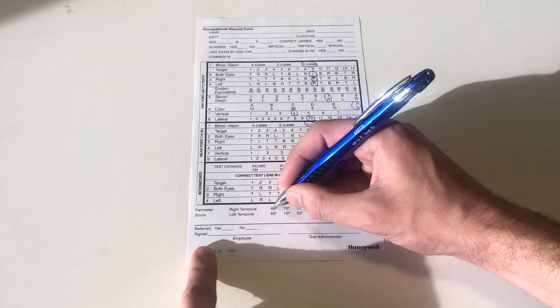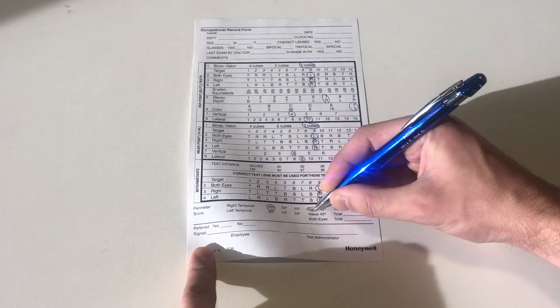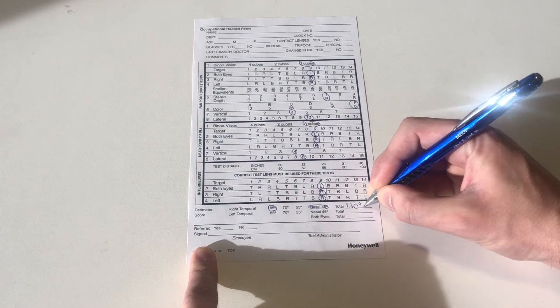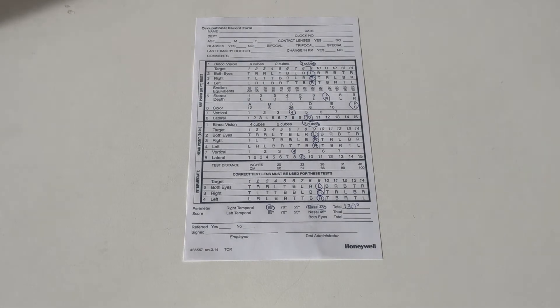For example, if the patient was able to see all of the lights, their temporal field of vision would be 85 degrees and their nasal field of vision would be 45 degrees, for a total of 130 degrees. Repeat the procedure for the other eye.